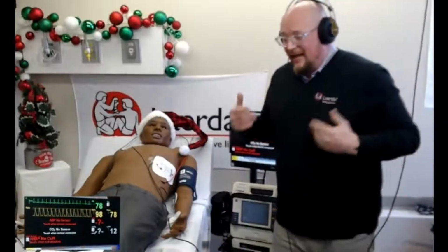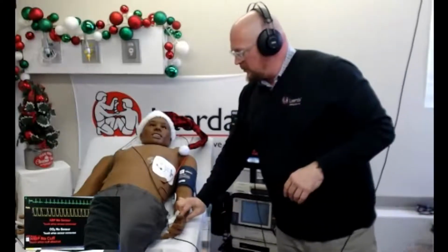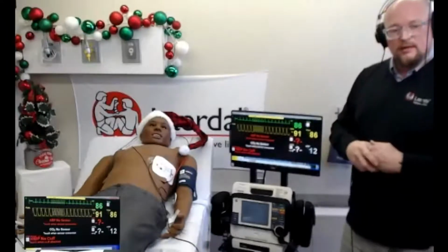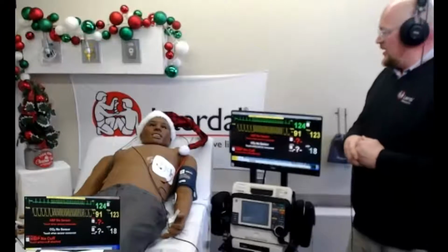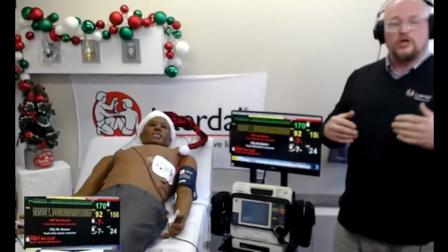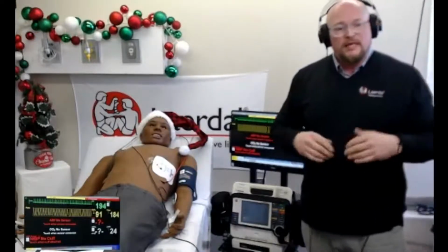So today, I've got him in normal sinus here. I'm going to hit his radial pulse, and all of a sudden this patient has gone into SVT. I'm feeling very dizzy. I bet you are. I bet you are feeling very dizzy. So what we're going to do right now is a synchronized cardioversion. It's a narrow complex QRS.